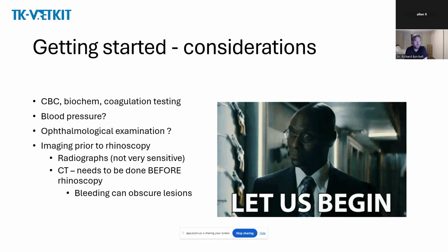And then imaging. Well, ideally, if you had the option and costs weren't a limiting factor, you would probably do a CT pretty much before every rhinoscopy if you had the option. And the reason for that is that if you do it afterwards and you cause bleeding and blood clots in the nose, you might need to wait a while before you can do a CT so that you don't have bleeding or fluid in the nasal passages obscuring lesions. And so ideally you do a CT prior to.